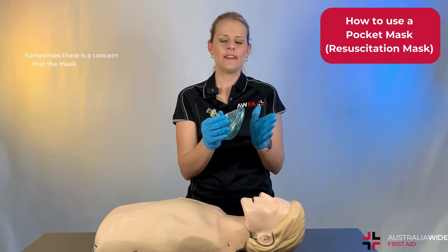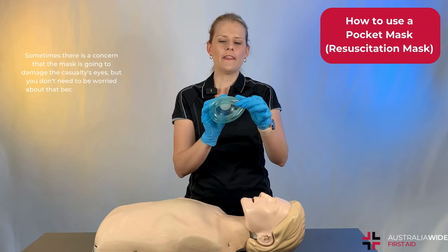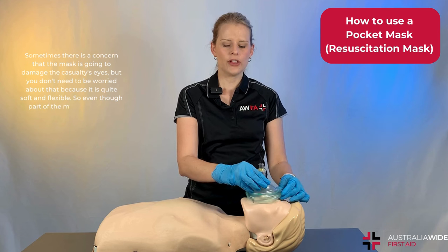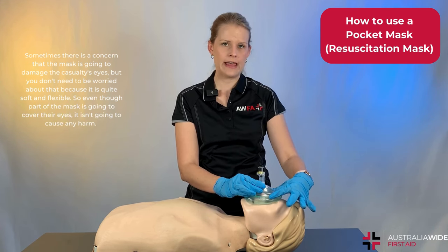Sometimes there is a concern that the mask may damage the casualty's eyes, but you don't need to be worried about that because it is quite soft and flexible. So even though part of the mask is going to cover their eyes, it isn't going to cause any harm.